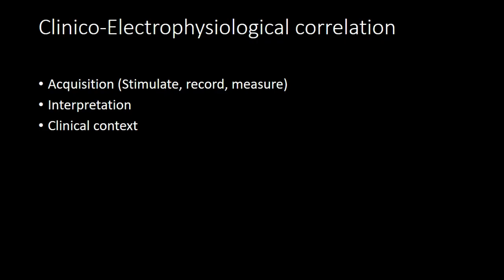But it is very interesting: if you don't have the clinical context and the exact question, it's like shooting in the dark. So you won't be getting good enough information to put your nerve conduction study and give a proper interpretation of what's going on with the patient.